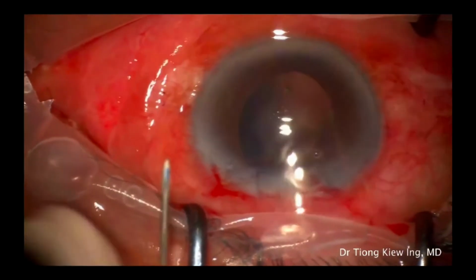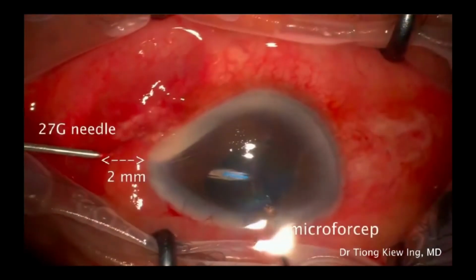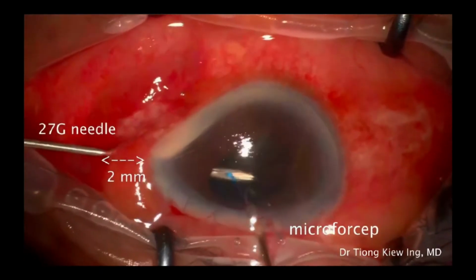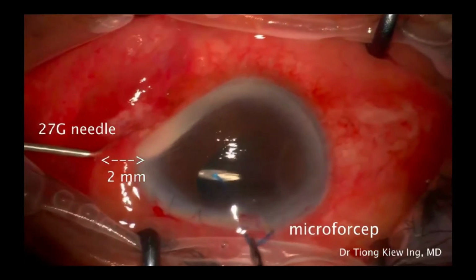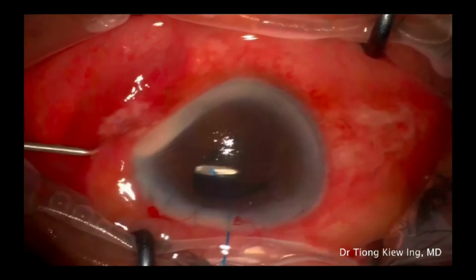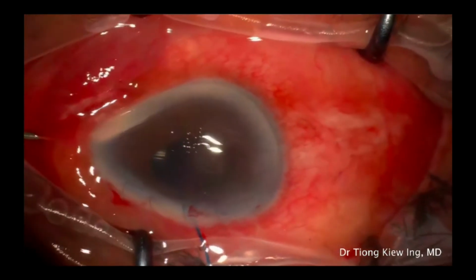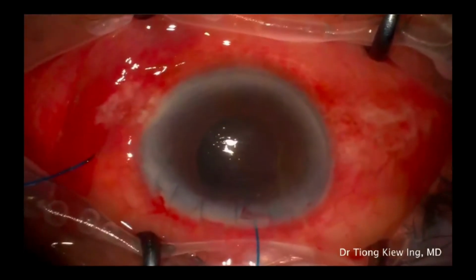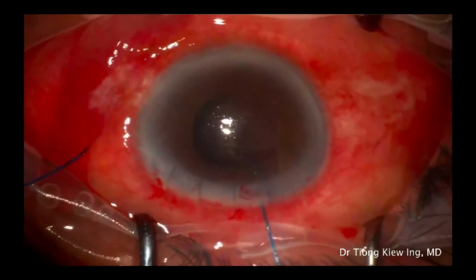A sclerotomy measure 2 mm from the limbus is made at one side using this 27-gauge needle. The preloaded suture is then advanced slowly until the suture is visible. The microforceps is then used to grasp the suture and exteriorize it. As you can notice, the eyeball is soft during the first sclerotomy.